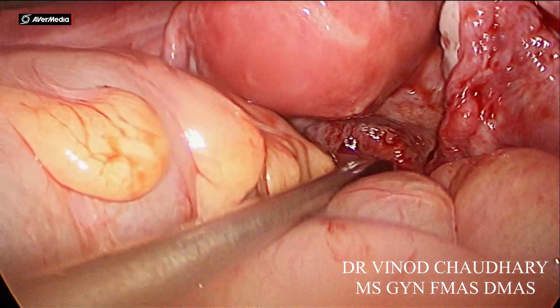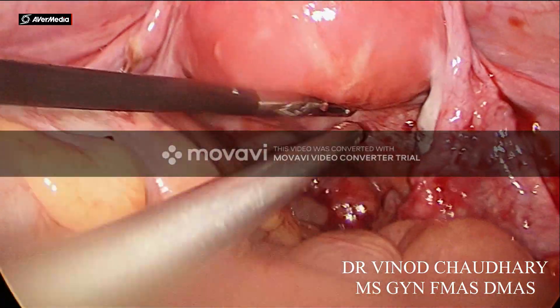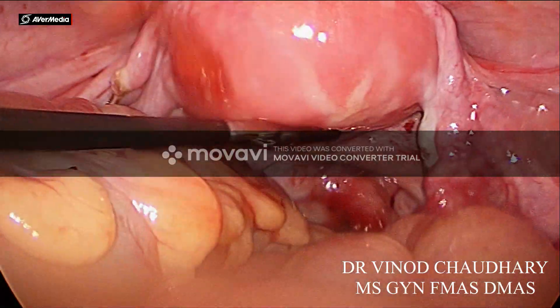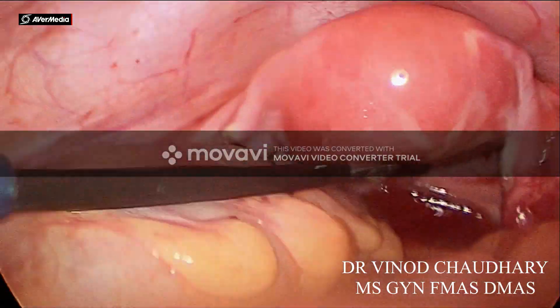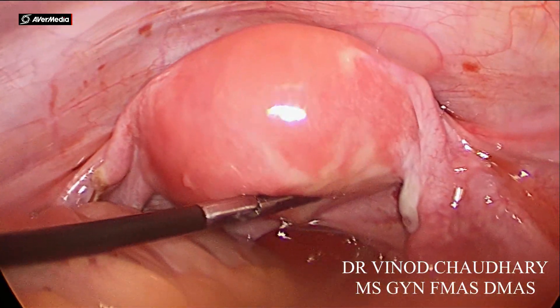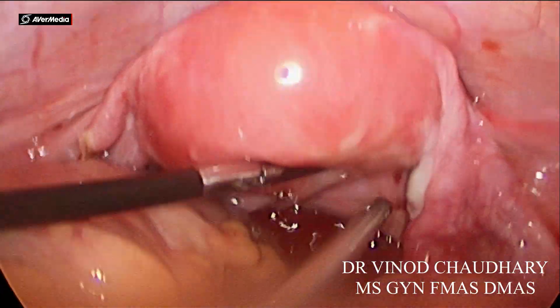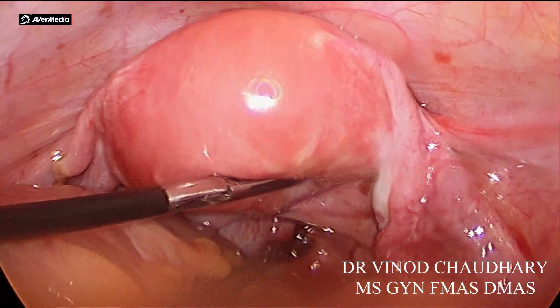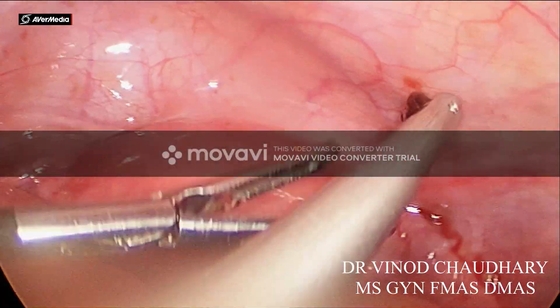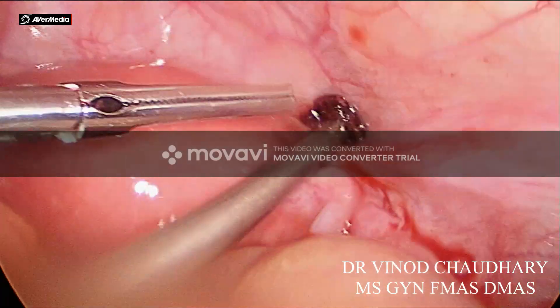The best area to do suction is the pouch of Douglas, because the omentum and other structures will not come inside the suction as easily. Now we are doing a little more cleaning. The small clots we are taking out with the grasper.